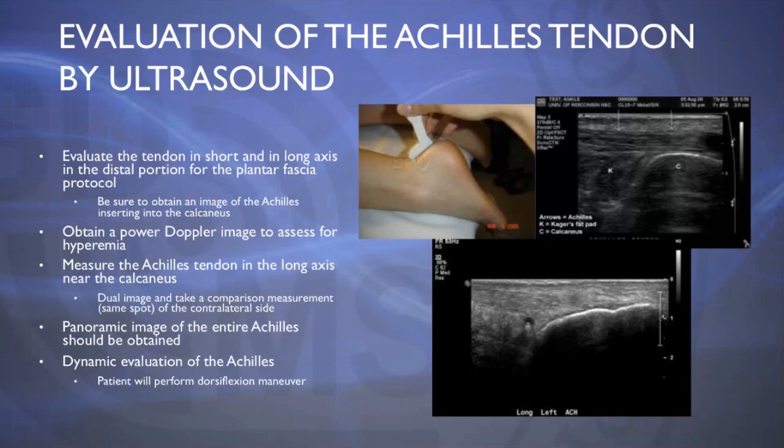And then we can also do a panoramic image of the entire Achilles, as well as a dynamic evaluation where we have the patient perform a dorsiflexion maneuver. And this is just showing you where you place your probe and how this will look at that distal insertion site.